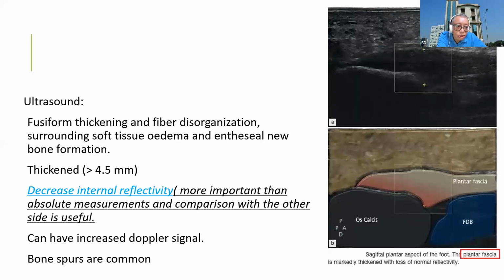So this is the plantar fascia, and this is the area of the pathology. I have to come from here in plane or do multiple puncturing. If you are giving PRP, this is the area to inject. Here, distally, this is the normal echotexture of the ligament, and here you can see loss of echotexture of the ligament. This is the area at the site of attachment to the calcaneum, the site for injection of the PRP. Or if you are giving steroid, above the plantar fascia and below the plantar fascia is the site of injection, not inside the plantar fascia.